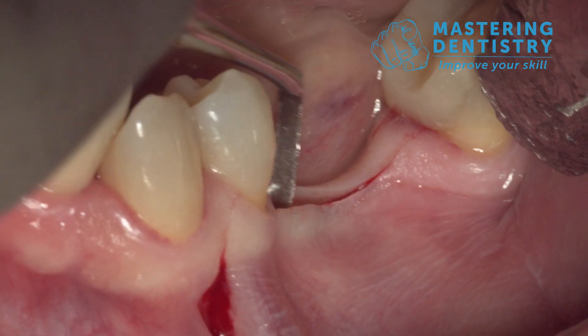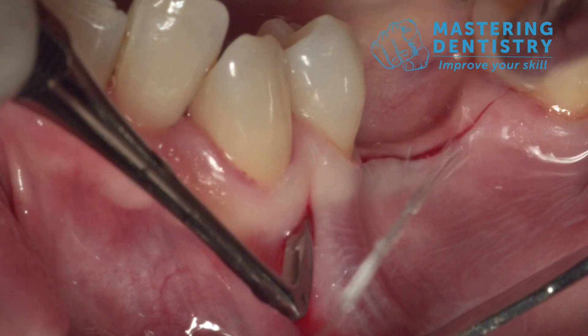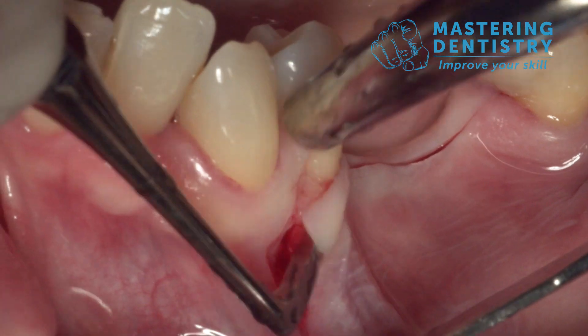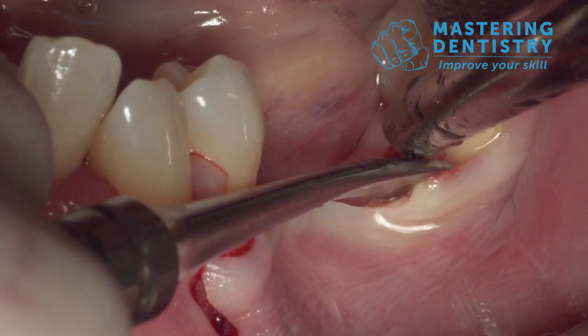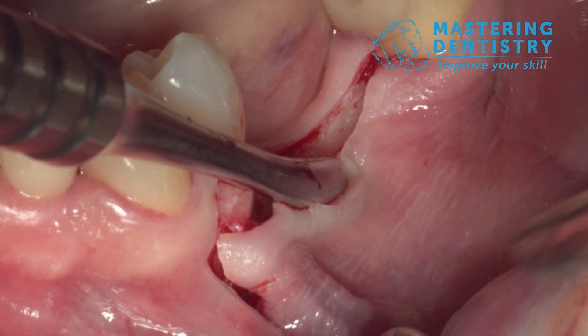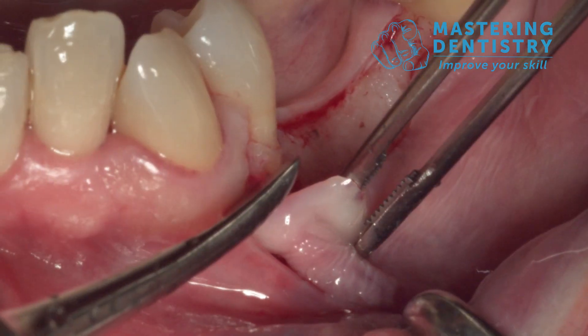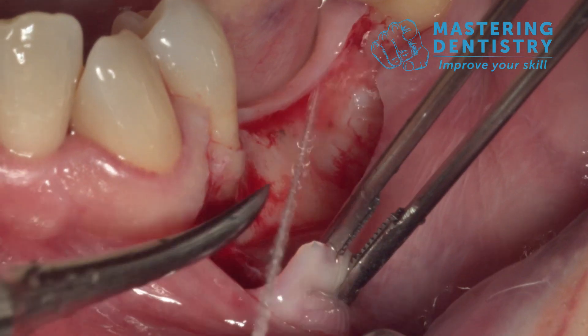Then I refine the incision with the Mitchell Dissector, also along the vertical incision, and I start leveraging the flap on the distal tooth. Then I turn the periosteal elevator upside down and continue in the mesial portion, going toward the apical side.